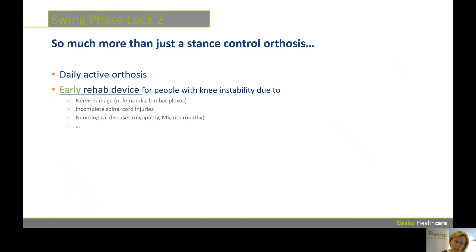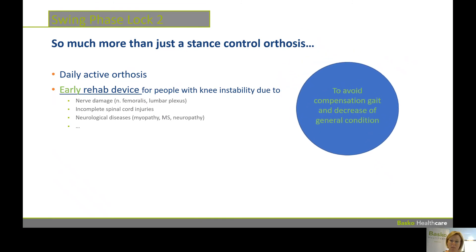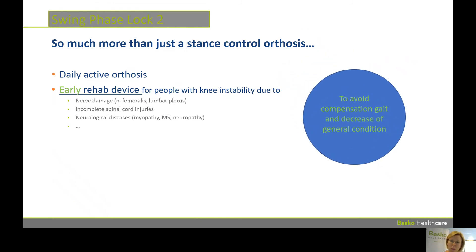Swing Phase Lock is so much more than just a stance control orthosis. As we saw, you can use it as a daily active orthosis, but it's also a rehab device that can be used in a really early stage in rehab. It can be used for people with knee instability due to nerve damage, incomplete spinal cord injuries, or neurological diseases. It's very important to avoid compensation gait and a decrease of general condition during rehab.